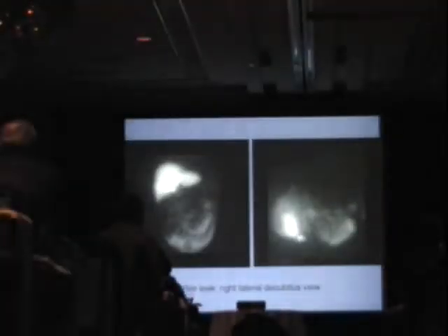This is a patient, this is a bile leak. Post-cholecystectomy patients sometimes have suspected bile leaks. And so you start to see tracer here in the lower parts of the peritoneal cavity. And that's an abnormal finding. And you can see it sometimes going up the pericolic gutter. You can sometimes see it coming down here.